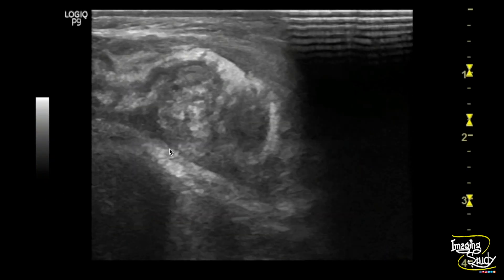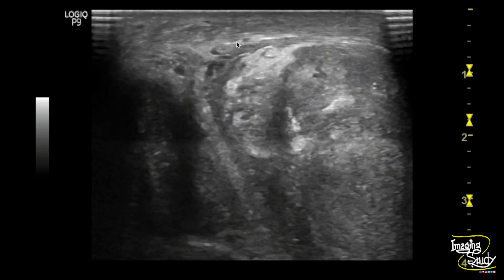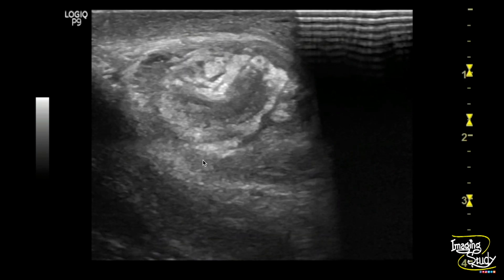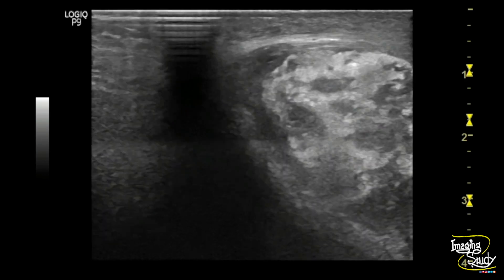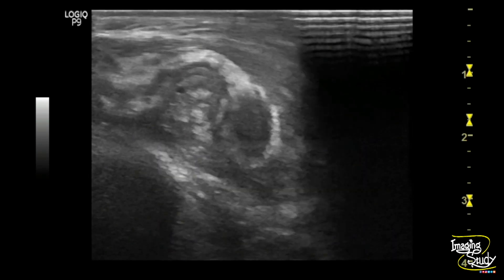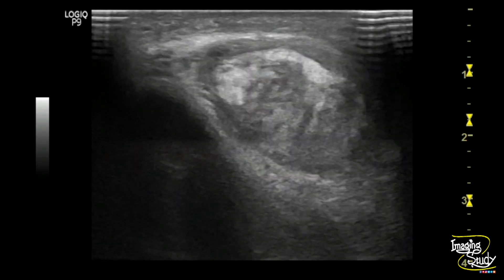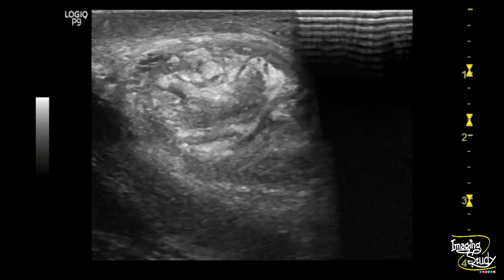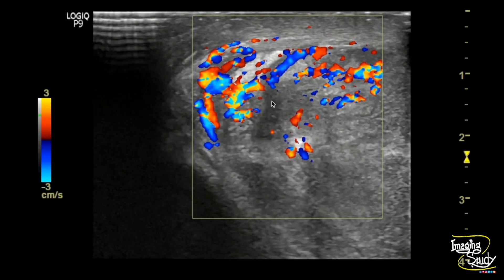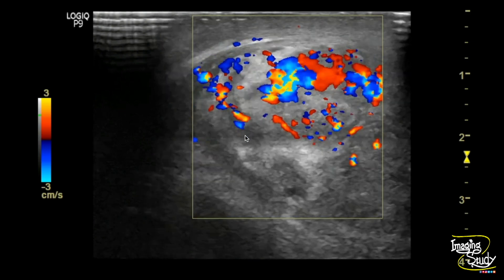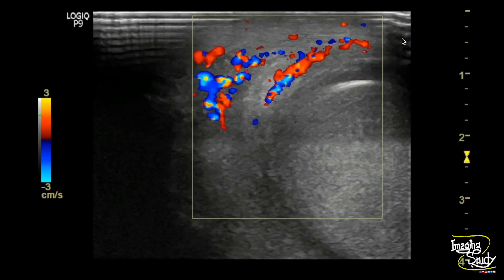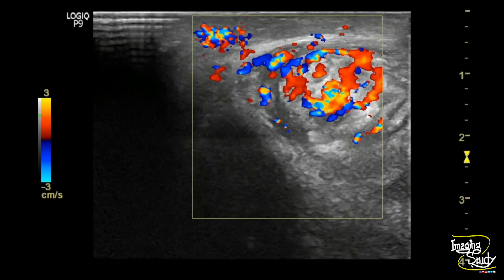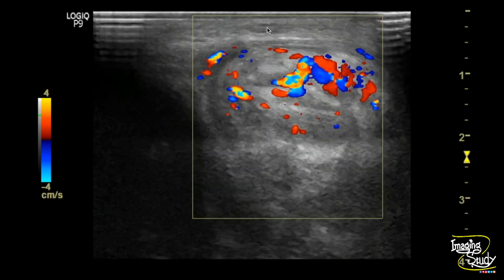Here you can see superior to the left testis a lamellated mass with concentric layering is noted. This is actually the coiled spermatic cord components forming the whirlpool sign — it means this is the site of torsion. On color Doppler you can see twisting or whirling of the blood vessels forming the whirlpool sign.